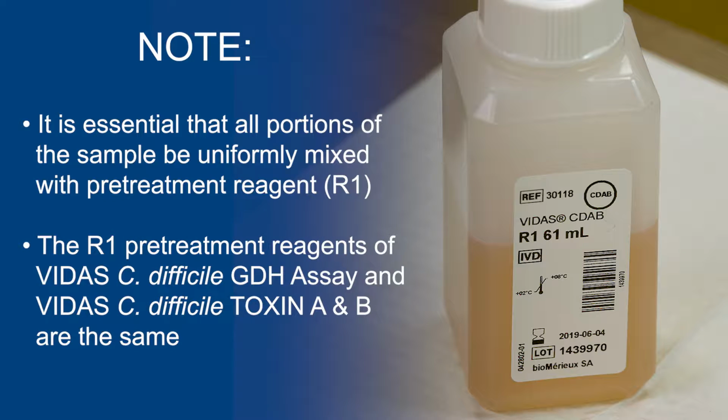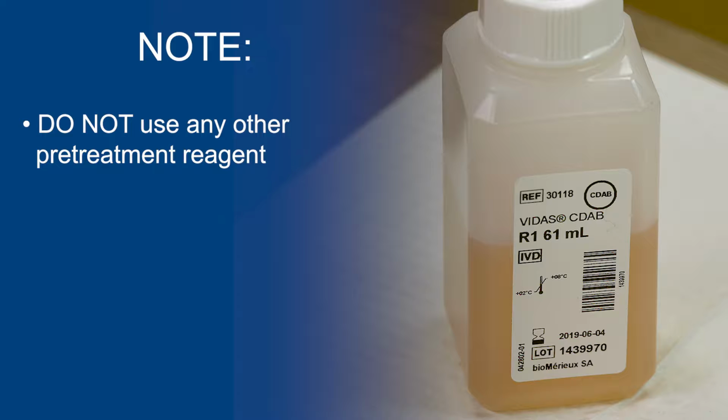The R1 pre-treatment reagents of VIDAS C. difficile GDH assay and VIDAS C. difficile Toxin A and B are the same. Do not use any other pre-treatment reagent.